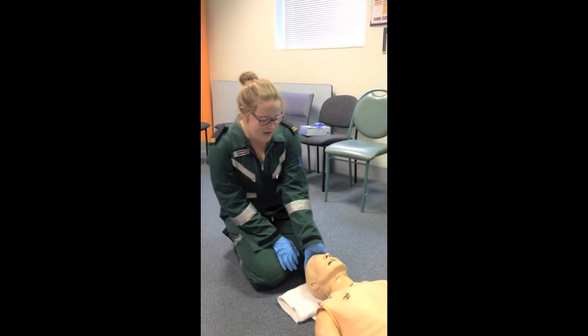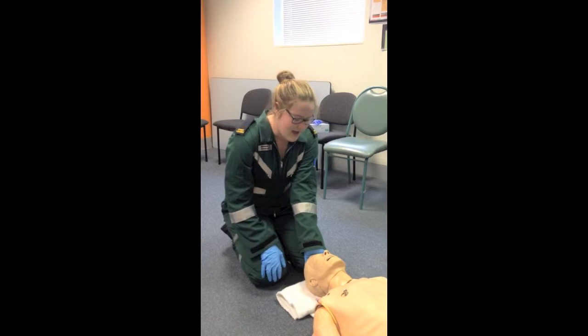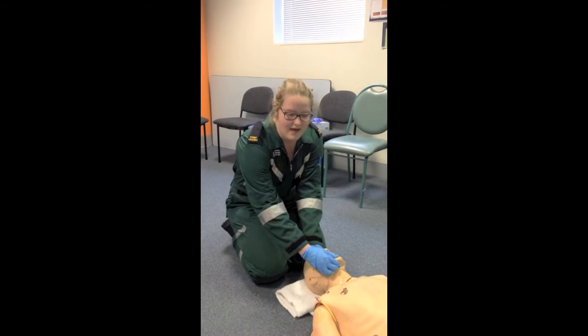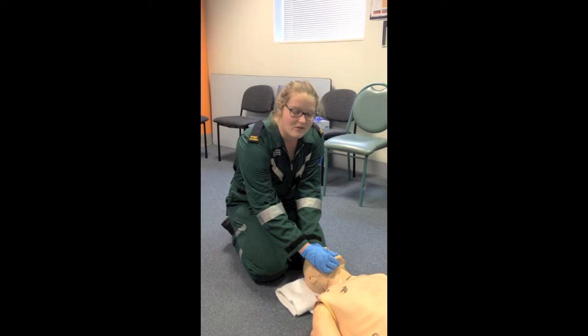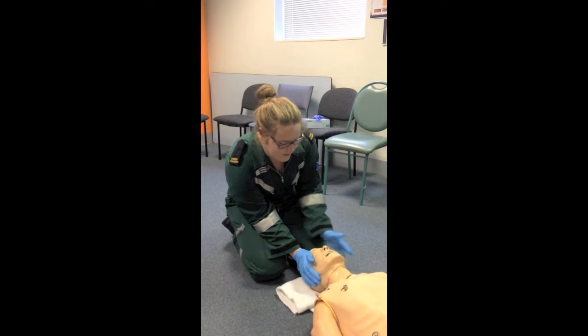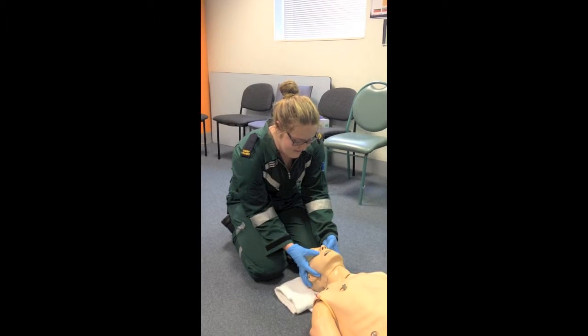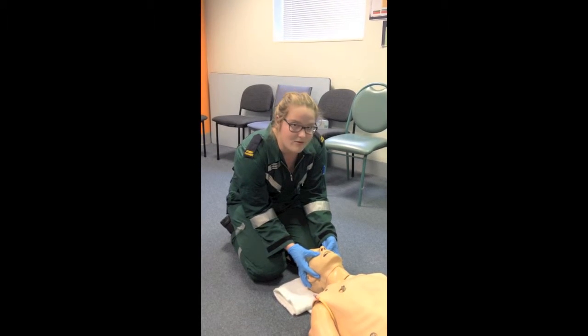This straightens the airway and allows them to breathe more efficiently, and you can also get a better view. So you need to tilt the head back with your hands and use a pistol grip to pull the chin out, and that's called the sniffing position. To complete the triple airway manoeuvre, you need to put your fingers behind the angle of the jaw and your thumbs on their face and thrust the jaw upwards and outwards.